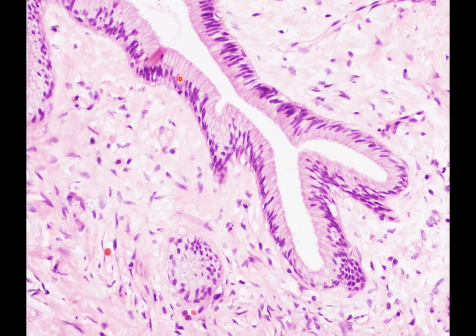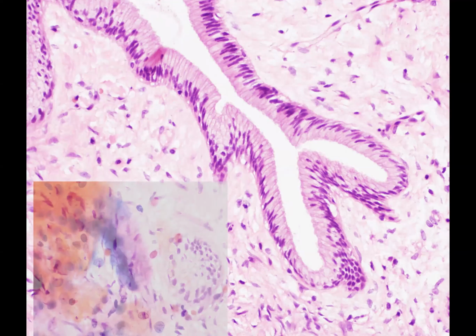Some of them come up into almost the middle third of the cells, and they have a lovely plume of clear cytoplasm above them, and if you could do a DPAS Alcian blue, you would see that this is full of mucin. Depending on how the section is cut, they either look columnar, as you can see here, or here, if they're transected, you have a more honeycomb appearance with a regular arrangement of endocervical cells, and here a regular arrangement of the nuclei.